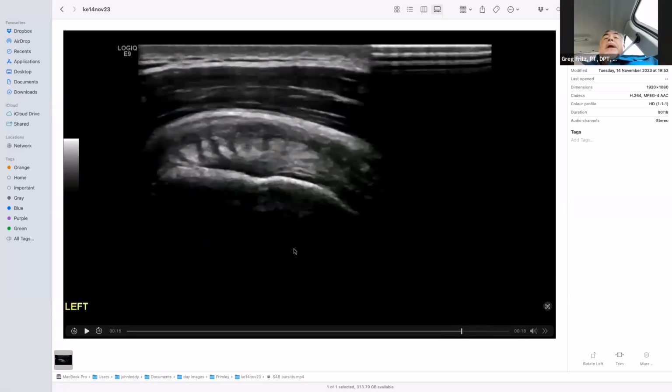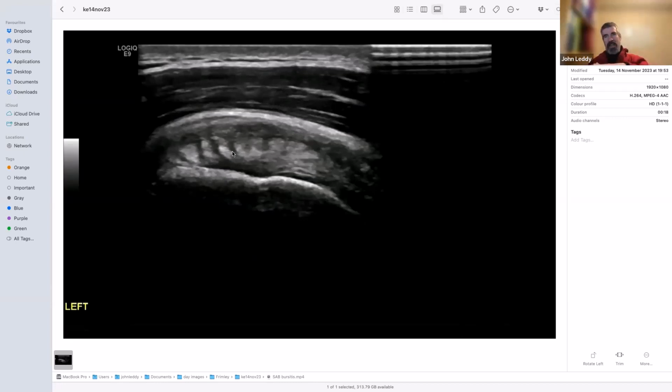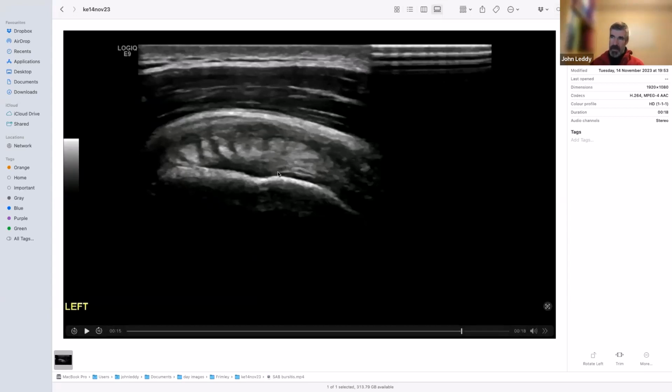Whenever I see that, John, and I use the term interdigitated with supraspinatus, you give me the head shake and you go, "No, that's not it. That is infraspinatus. I see on ultrasound very little interdigitation. What you see mostly is infraspinatus lying on top of the upper border of it." Infraspinatus lies on top of supraspinatus, and you see those fibers very clearly as short axis fibers with the long axis fibers of supraspinatus, the posterior part of supraspinatus lying underneath them.